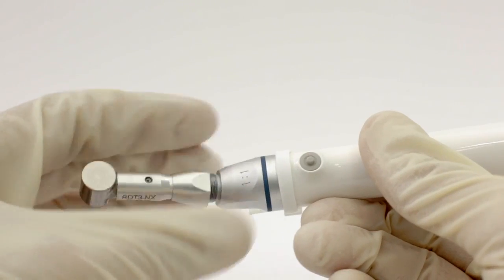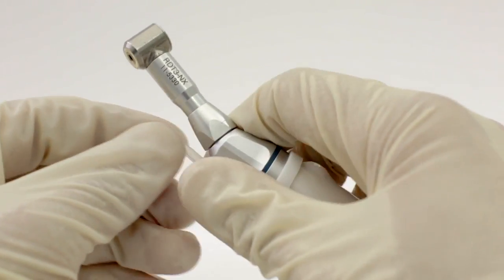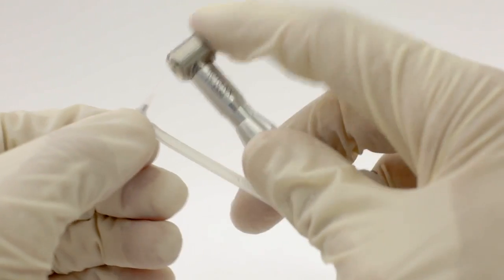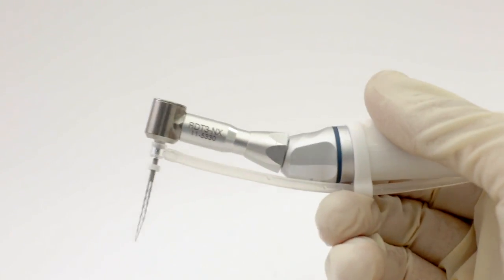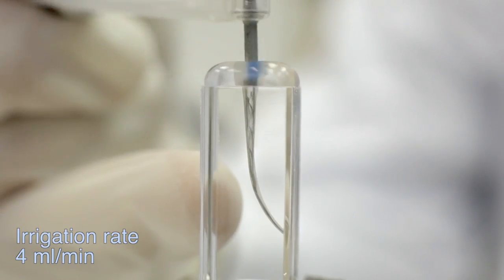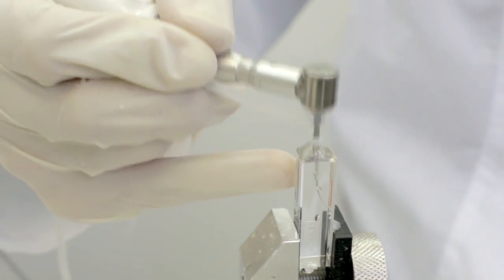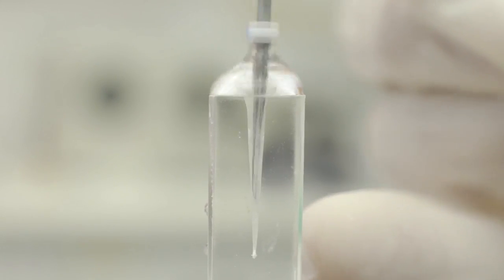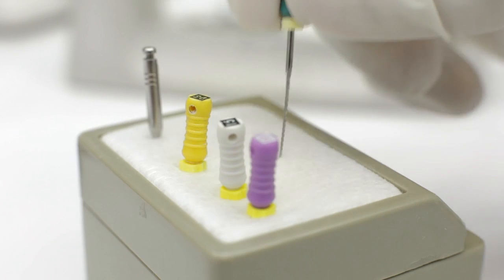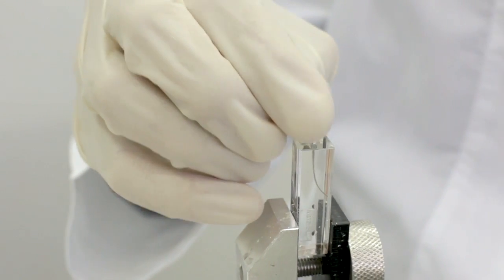Excessive apical pressure at this stage may damage the file. Treat each canal using light pecking motions for 4 minutes with a recommended irrigant flow rate of 4 milliliters per minute. When used properly, the file is rotating to change its axial position only during the outbound stage of the pecking motion. Prior to obturation, gauge the prepared canal using gutta-percha master cones or NiTi hand files to determine final canal dimensions. Final canal dimensions are expected to be 2-3 ISO sizes larger than the initial apical size.